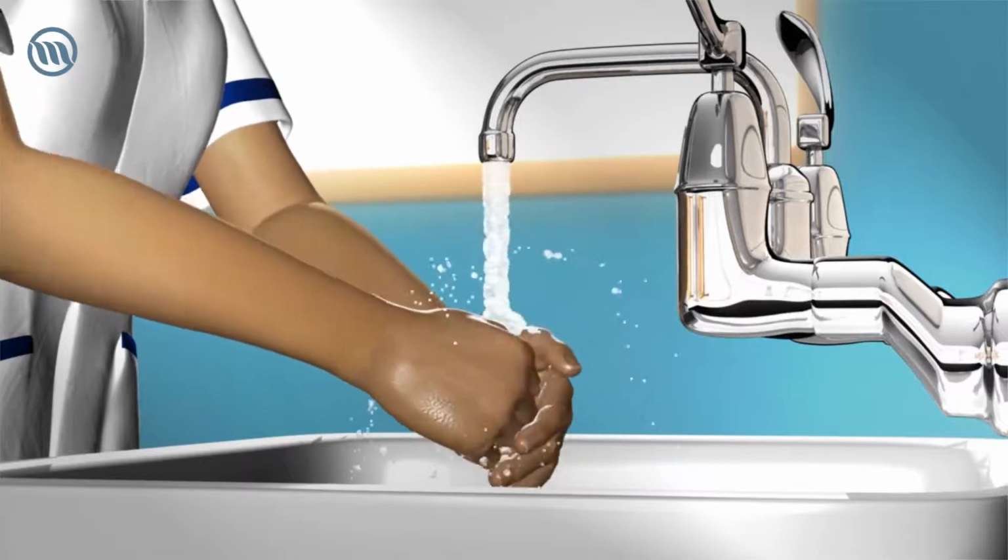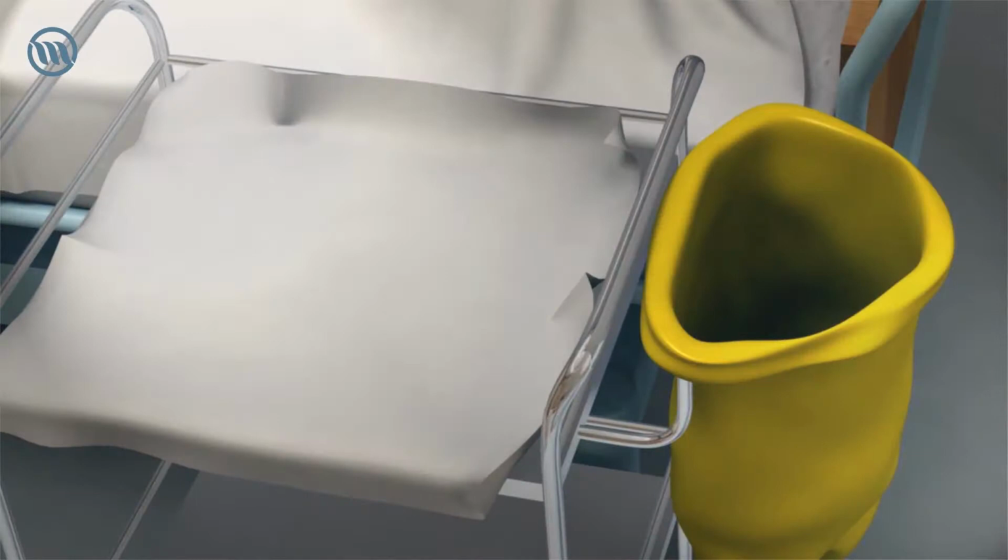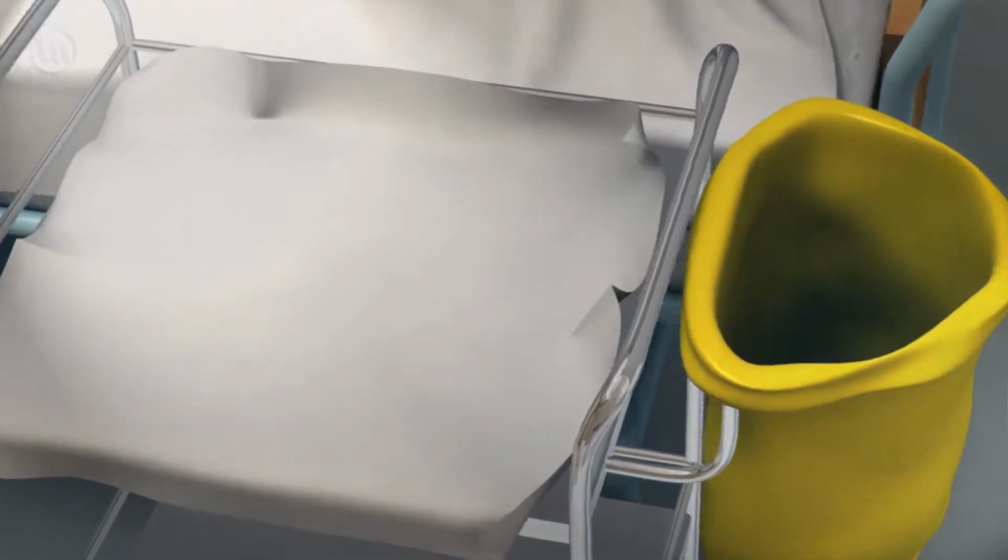Then wash your hands in line with your trust hygiene policy. Make sure you are fully prepared and have everything you require for the procedure. Identify and clean a suitable surface to lay out your equipment. In a hospital setting, this is usually a dressing trolley. In a patient's home, it may be a tray or similar flat surface.